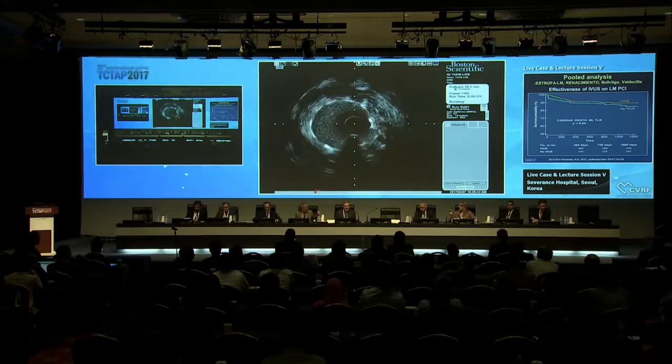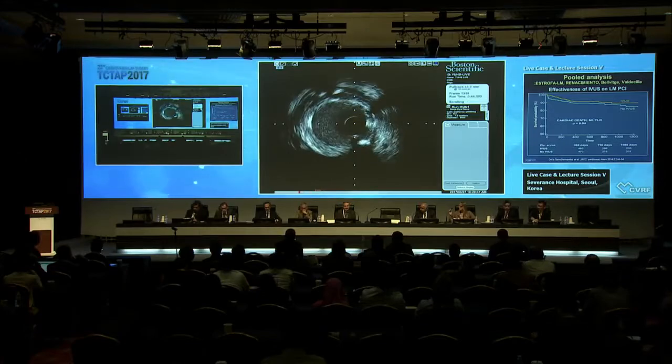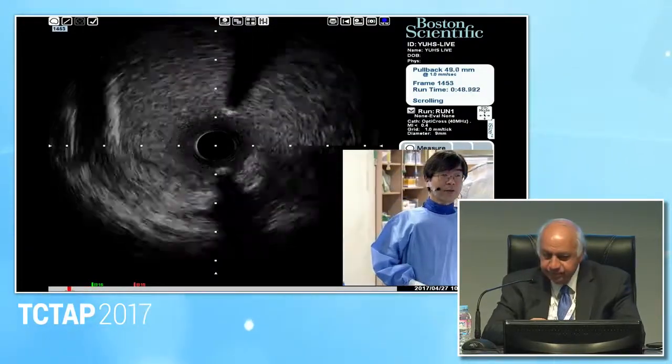I mean, with mild disease, is it wise to put another stent after putting a stent in the left main, or do you make it with IVUS from the beginning and take a long stent from the ostium to the LAD? What are the differences? Because overlapping stents in the left main is not good for the patients. What do you think? I think so.